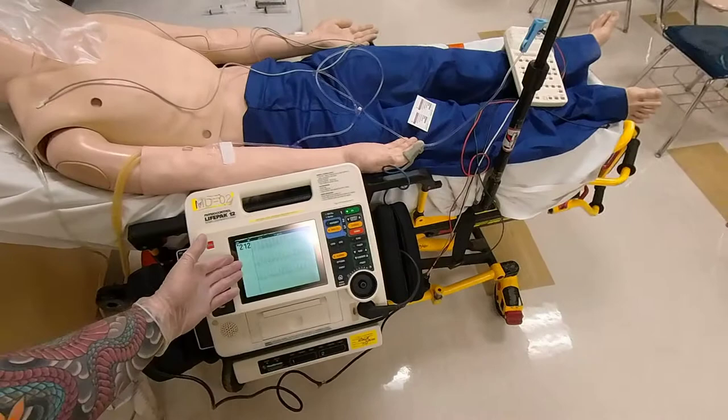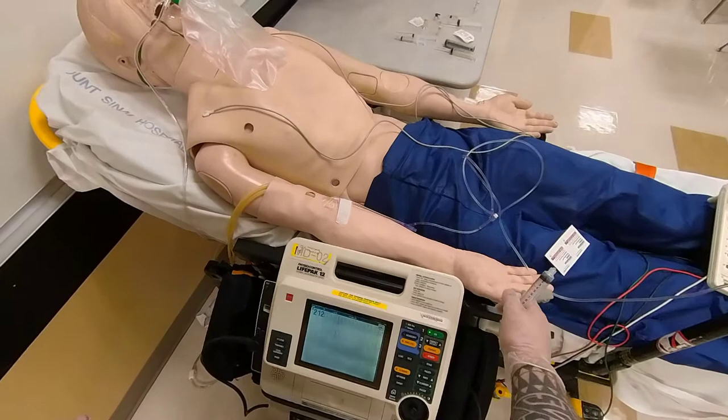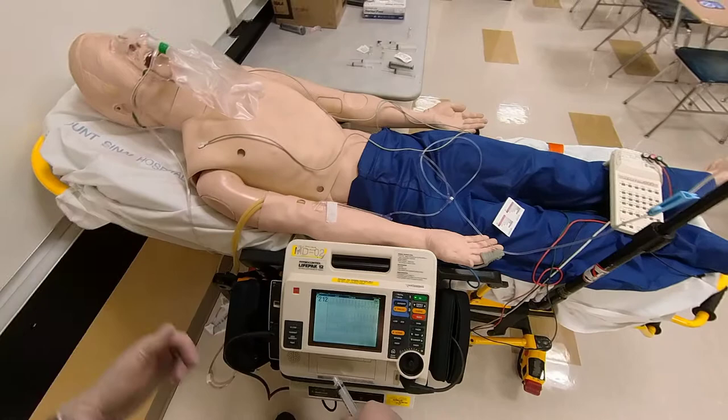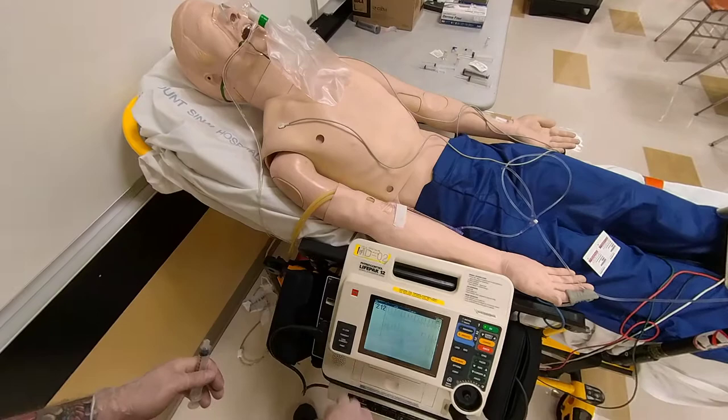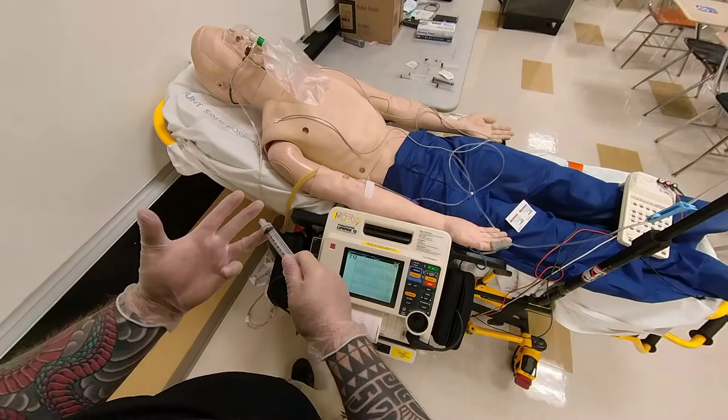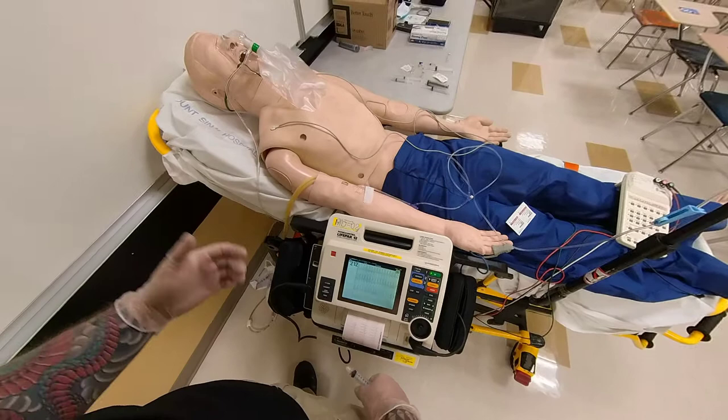At this point, we already have placed the patient on the monitor, acquired the blood pressure, placed the pulse ox, and if the patient is saturating less than 94%, we have provided supplemental oxygen. We have determined that the patient's blood pressure is 140 over 90. The rhythm is supraventricular tachycardia — I can print a rhythm strip to confirm. We determined the patient does not have chest pain, shortness of breath, hypotension, or confusion to warrant an essentially unstable dysrhythmia needing synchronized cardioversion. So the patient is stable with good mentation and is able to follow commands.